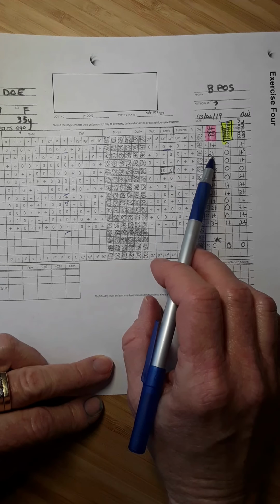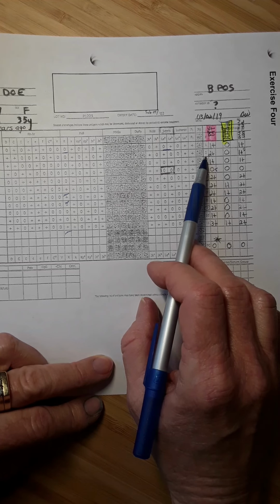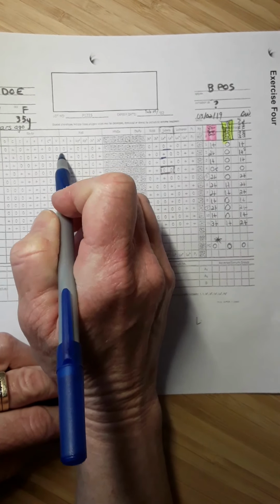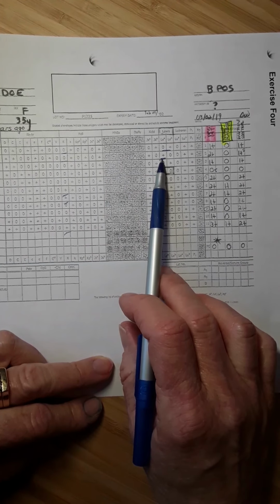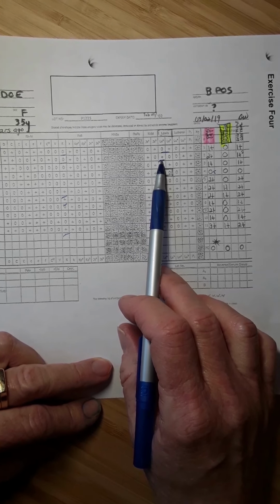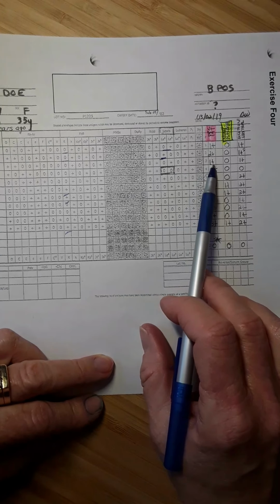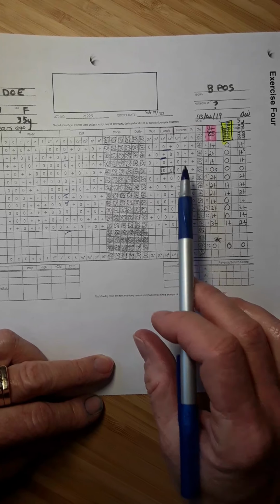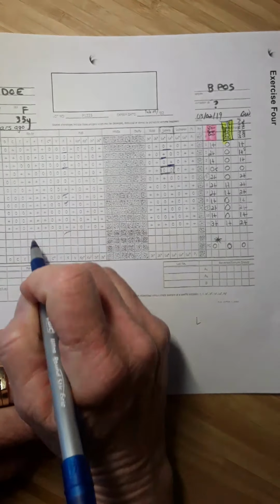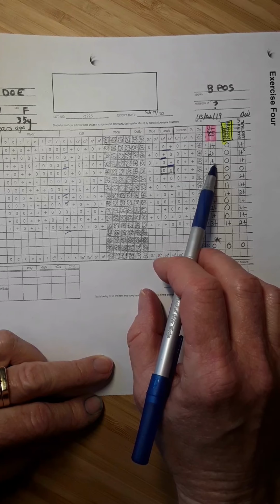Okay, now here I've got a 2+ reaction of the patient's plasma with panel cell 2. This cell is positive for Lewis A, it's negative for Kell. So I'm thinking, okay, well, the anti-Lewis A in the patient's plasma is reacting about 2+. Let's see if this pattern continues. Here I've got a 1+ reaction with panel cell 3. It has Lewis B on it and no Kell. Oh, okay, that's similar to my first cell. And sure enough, it's reacting 1+.